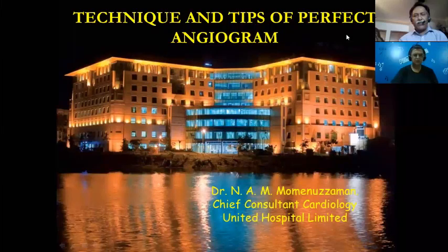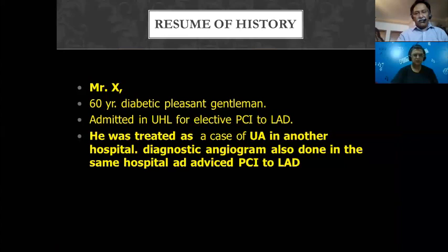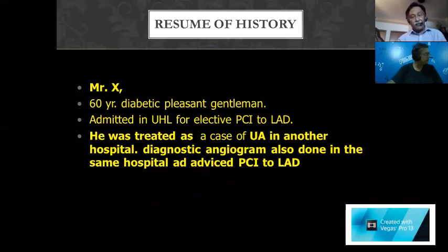Just opened up the eyes in making a perfect angiogram. Let us start with a history like Mr. X, 60 years old, diabetic, pleasant gentleman, admitted in my hospital for elective PCI to LAD.